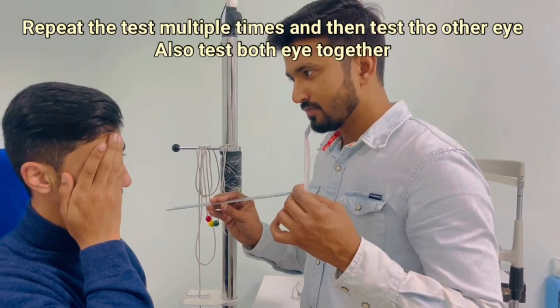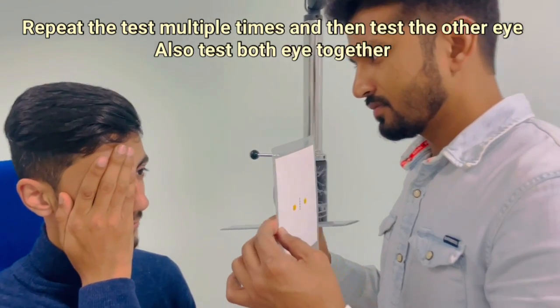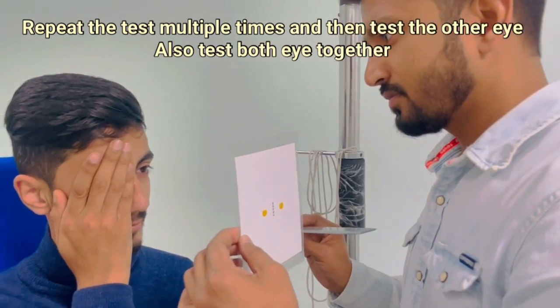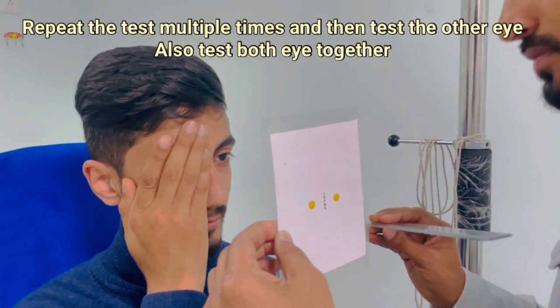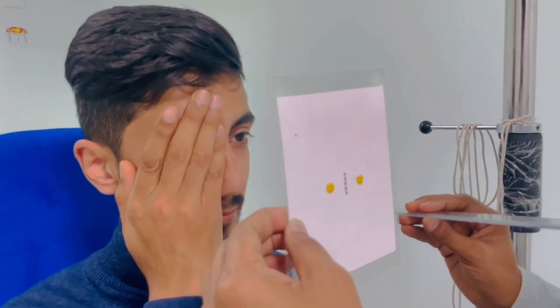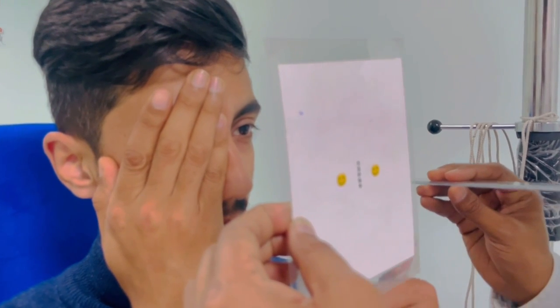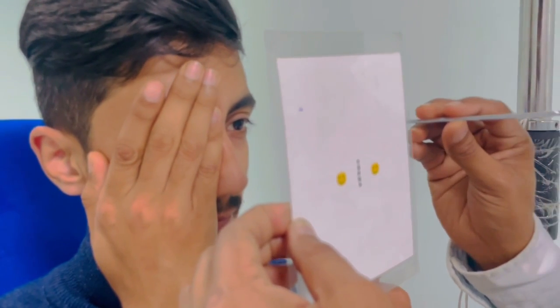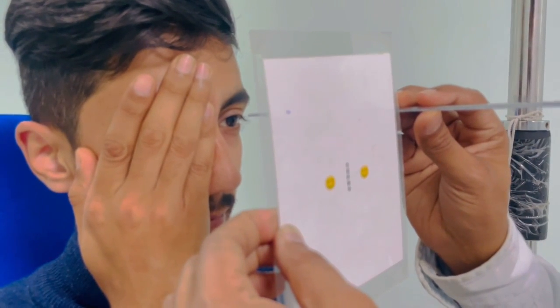Repeat this test multiple times, as accuracy is very important — even a small error in measurement can lead to a large difference in result. Then test the other eye and also perform the test binocularly.